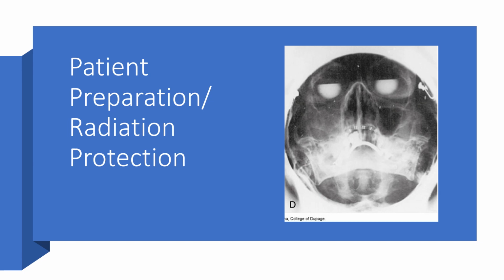I don't know how glass is attenuating X-ray that well, but it seems to be. And then of course the patient also has what looks like a partial denture plate in the lower mandible. Both of those could be removed and we get a clearer picture of the patient's skull.